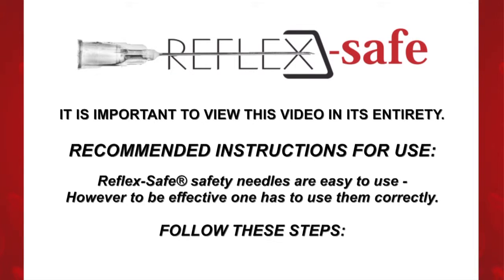Recommended Instructions for Use: Reflex Safe Safety Needles are easy to use. However, to be effective, one has to use them correctly. Follow these steps.